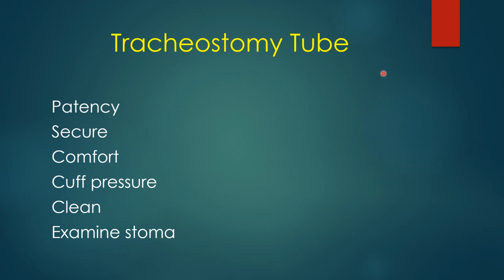And the patient may not have an endotracheal tube, he may have a tracheostomy tube. And there's some things you need to be aware of with the tracheostomy tube. If it's a fresh trach, then it can be painful. So you will want to make sure you really avoid traction on the tracheostomy tube. And again, you want to make sure it's patent, that there's no obstruction, and that it's secure. With a tracheostomy tube, the patient can cough and cough the tube out if it's not secured well.